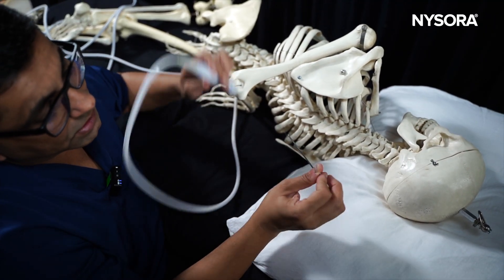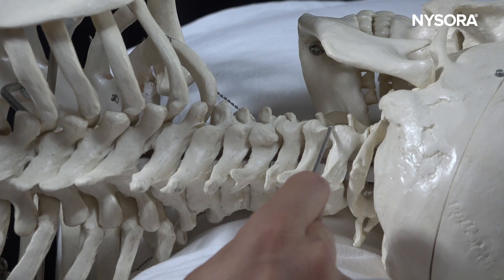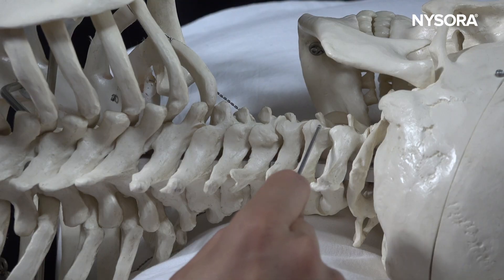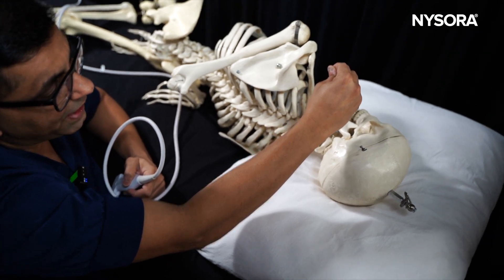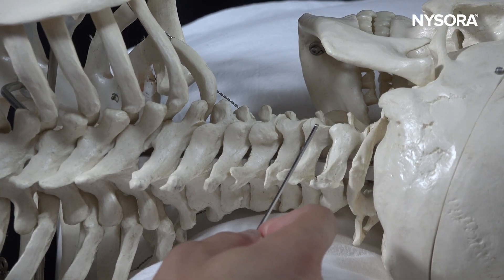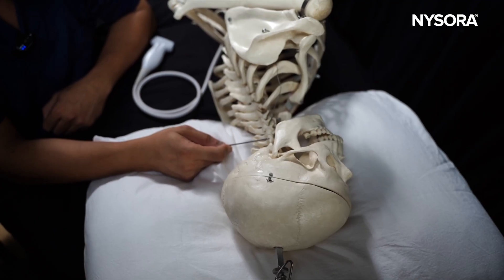To recap: start at the mastoid process, move down, look for the first joint which is the C2-C3 joint, look for the third occipital nerve, then look for the peak and trough. The peak is where you have a facet joint and the trough is where the medial branch is located. The injection technique will be out-of-plane going anterior to posterior, or transverse in-plane from posterior to anterior landing on the articular pillar. Use X-rays to confirm and fine-tune needle position when performing radiofrequency treatment.